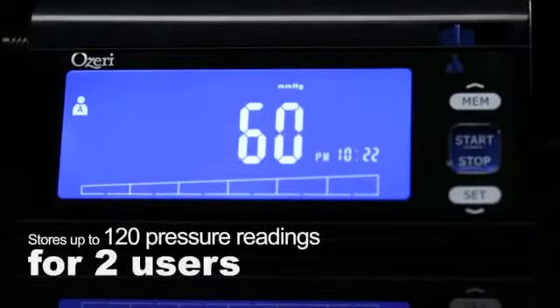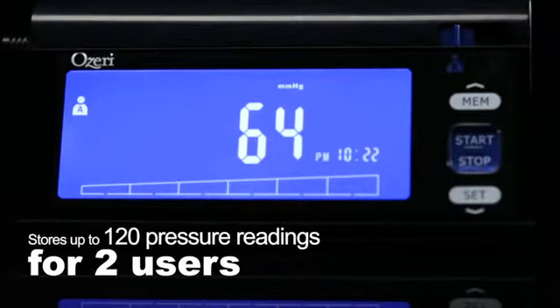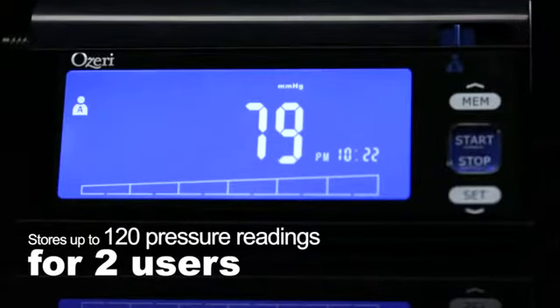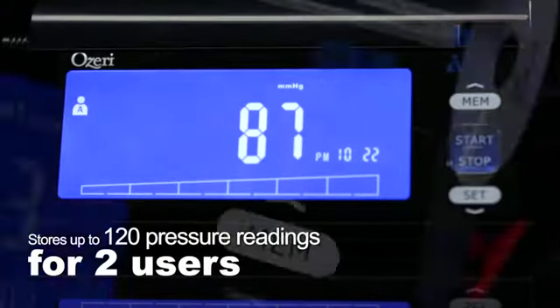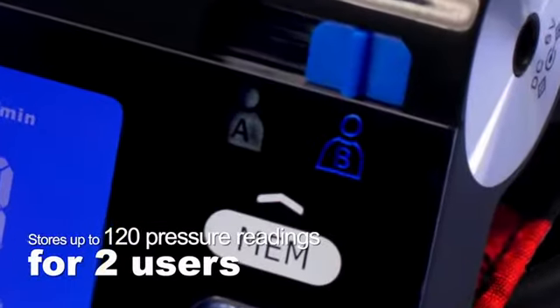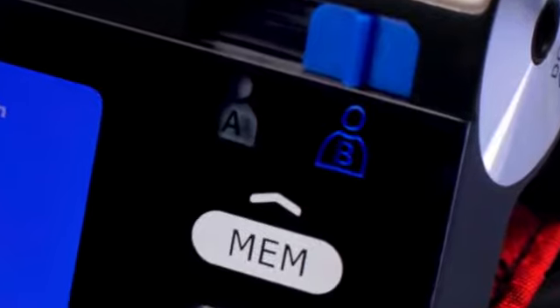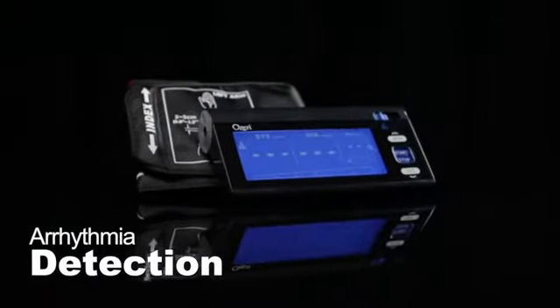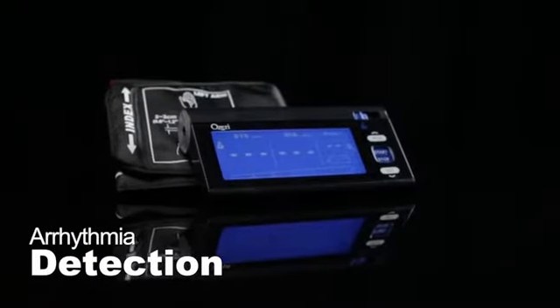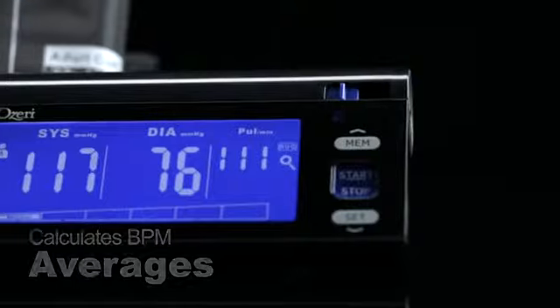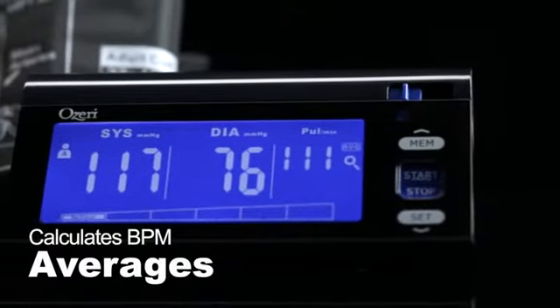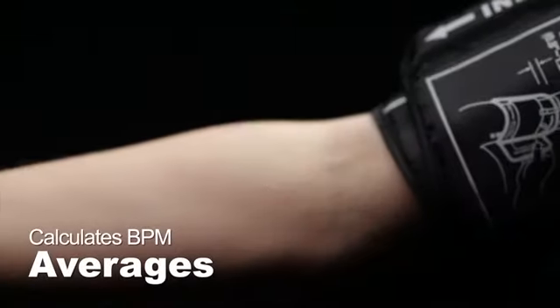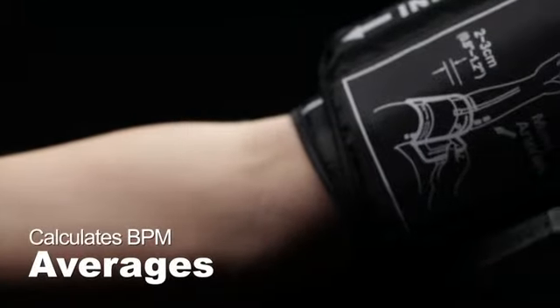Featuring memory that stores up to 120 blood pressure readings with date and time for two different users, smart indicators for heart rate and arrhythmia detection, and push-button access to averaged readings for a better understanding of your blood pressure.